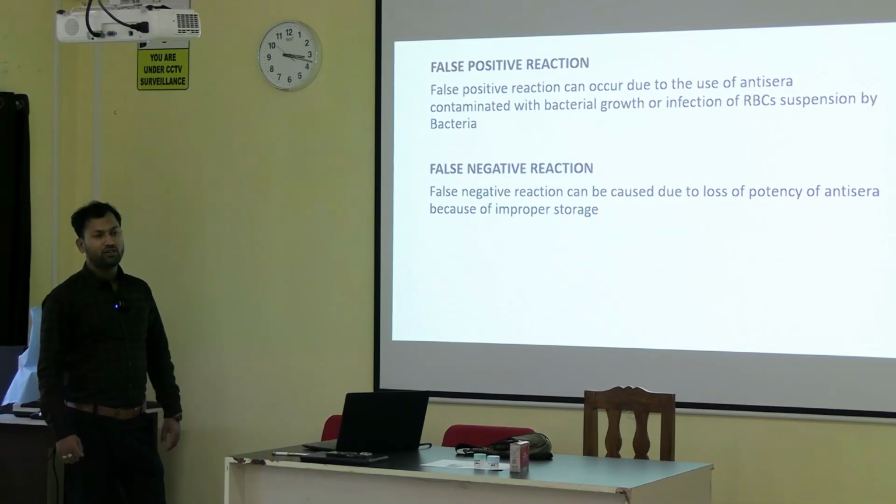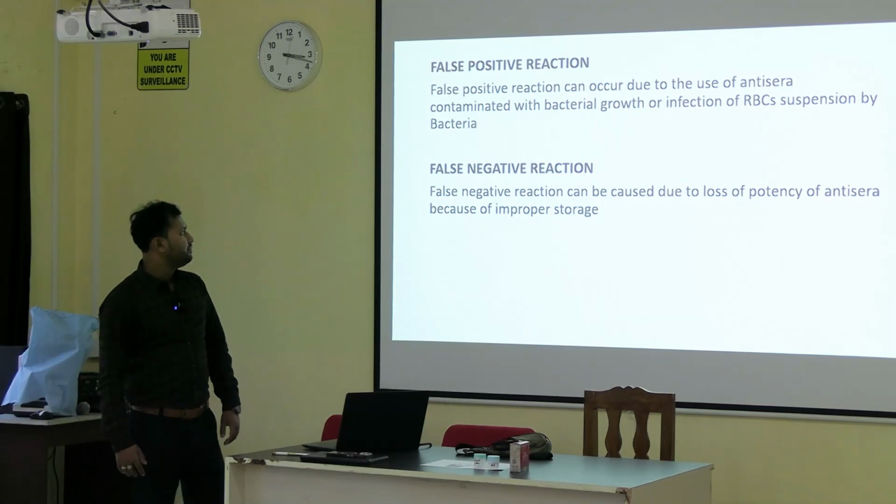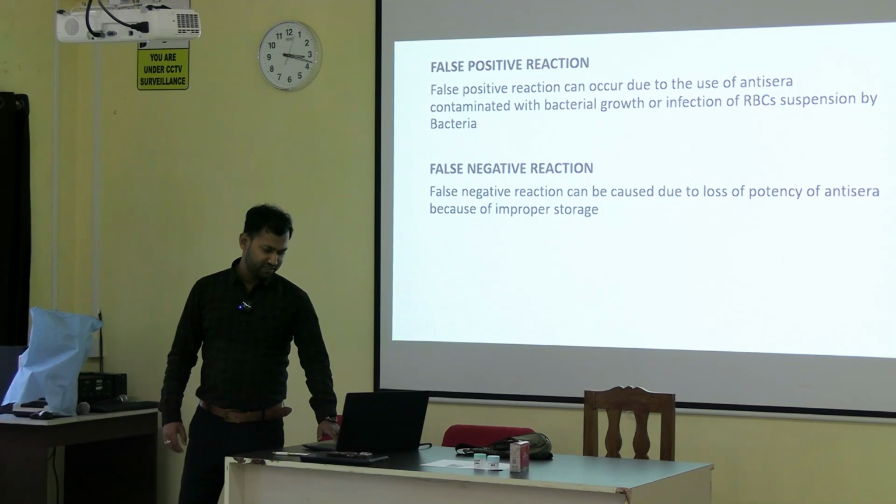And a false negative can occur if the anti-sera is not potent, means it is not actually working. If it is stored in such a way that it has lost its function, then the result is negative. It is a false negative reaction.